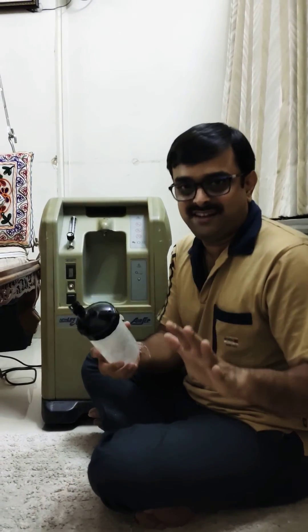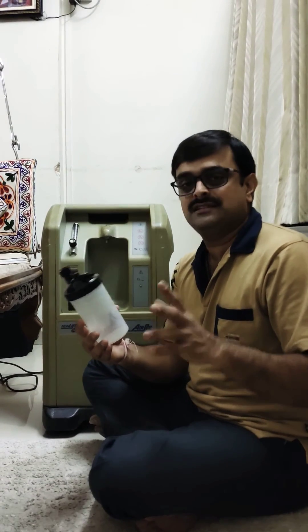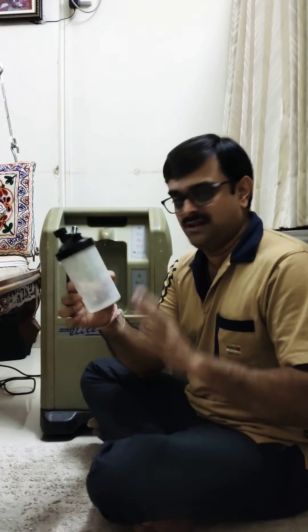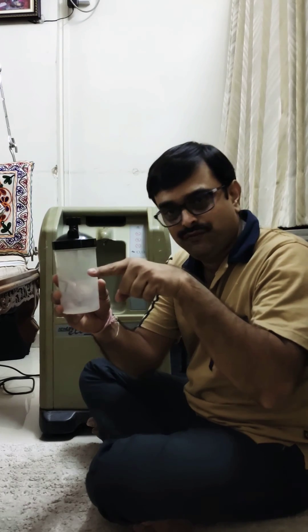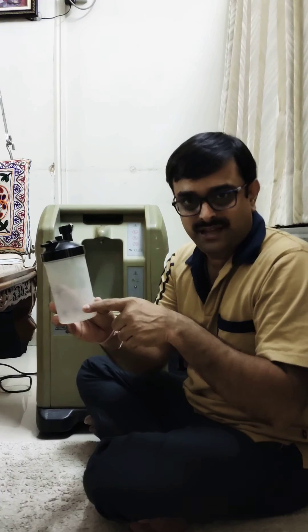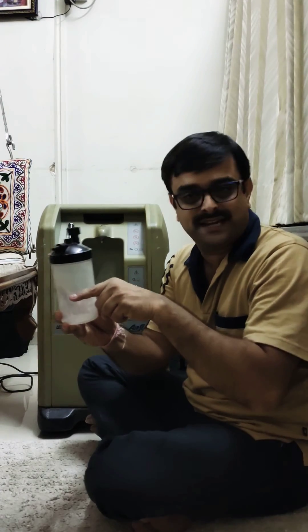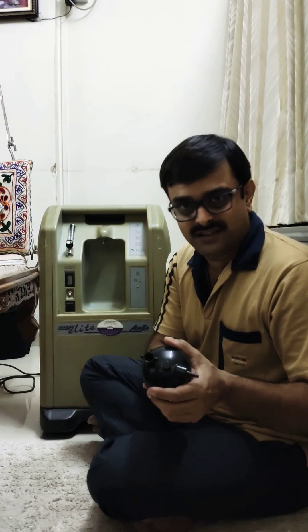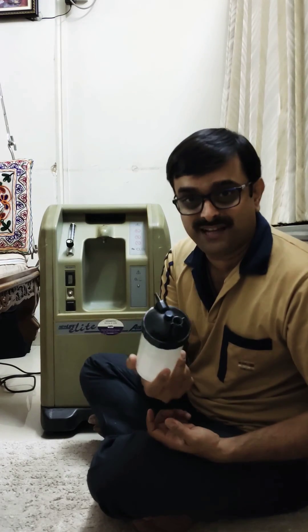I forgot one important thing — there is a question about how much water to fill in this bottle. As a general rule, just fill it to the half, 50%. You can always read the maximum and minimum markings, but if you don't want to go into the technicals, just fill it halfway. That should do for at least 12 to 16 hours of usage without any issue.